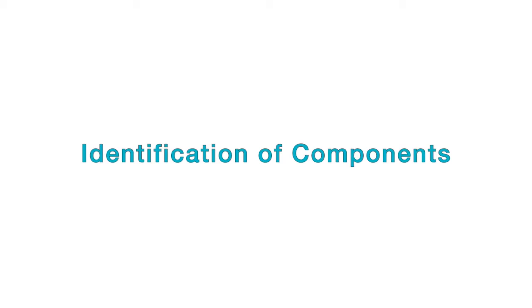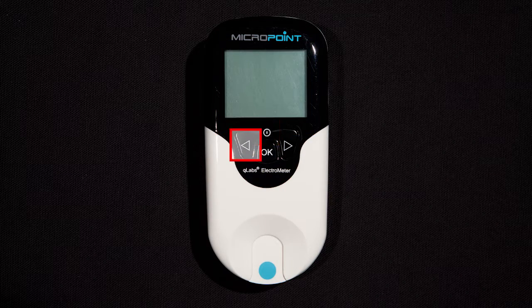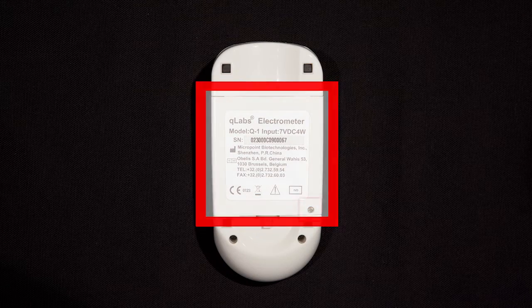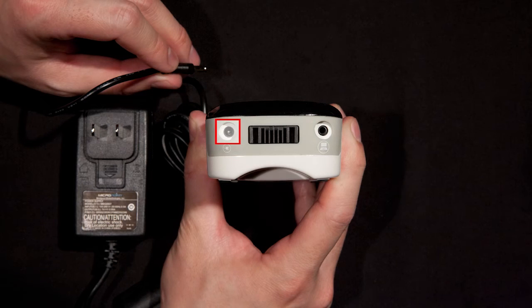Let's begin by identifying a few components on the Q-Labs Electrometer. In the front, we have an LCD screen, the power button, the left and right arrow, the OK button, and the test strip guide where the test strip will be inserted during testing. On the back of the Electrometer, we have the battery cover, the battery cover screw, and the battery cover release. At the top, you will find the power supply jack and the data port.